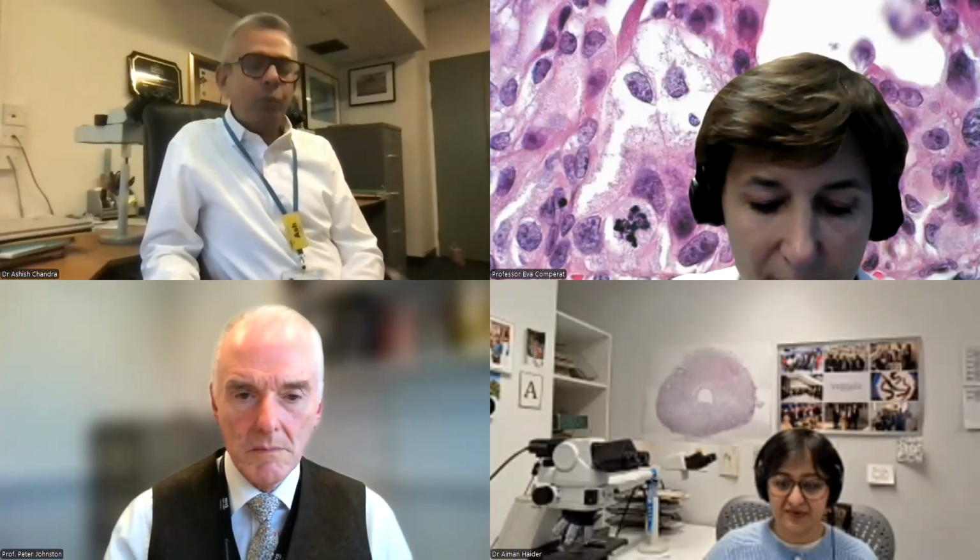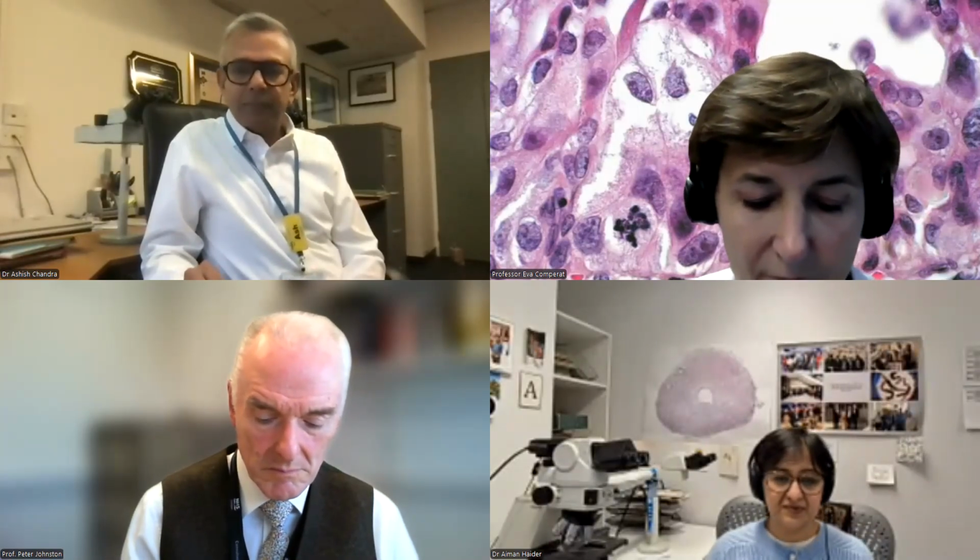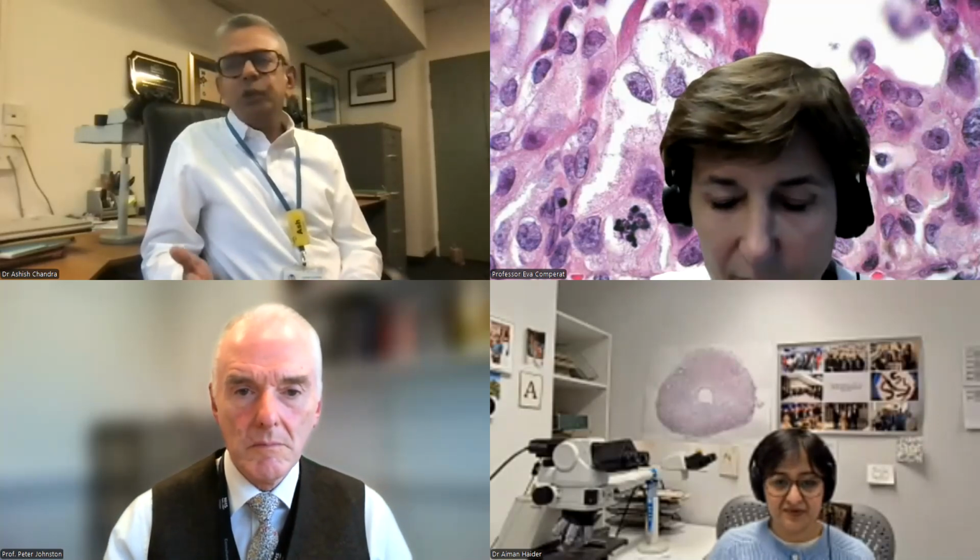So if you just bear that in mind, what is the rationale for getting a distal urethral margin? It's probably more important in men where the penile urethra has been left behind. And then you just try and get the distalmost part of the urethra, whether it is retracted back into the bladder neck in the case of a female bladder, or it's retracted into the prostate in the case of a male patient. Okay, thank you very much.